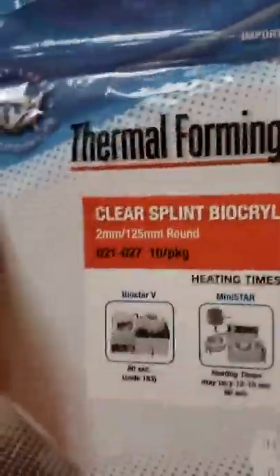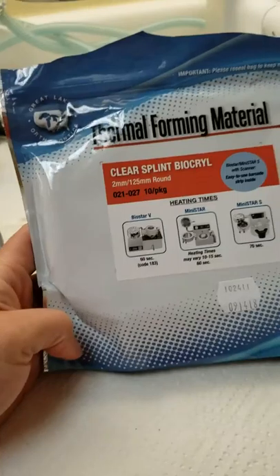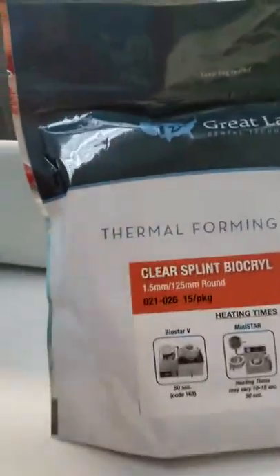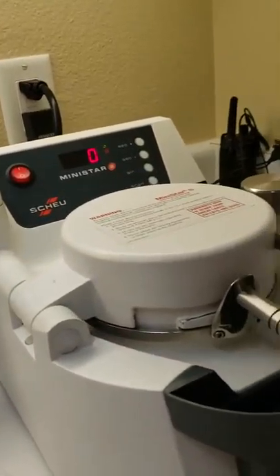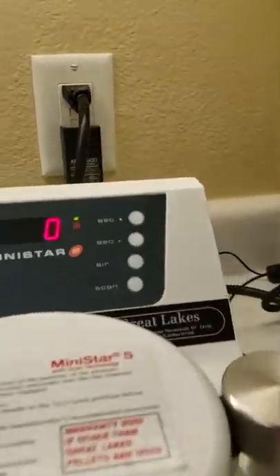The two-millimeter thickness is another option I use quite a bit more. Dr. Smith will sometimes make office night guards for patients who don't want a traditional night guard but need just a little bit of something — I'll use the two-millimeter for that. But the one-point-five millimeter is your standard size that you're going to use for everything.